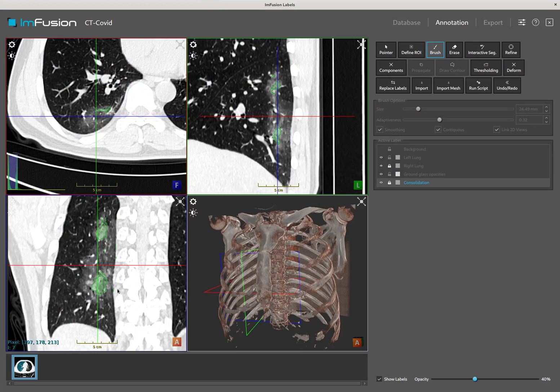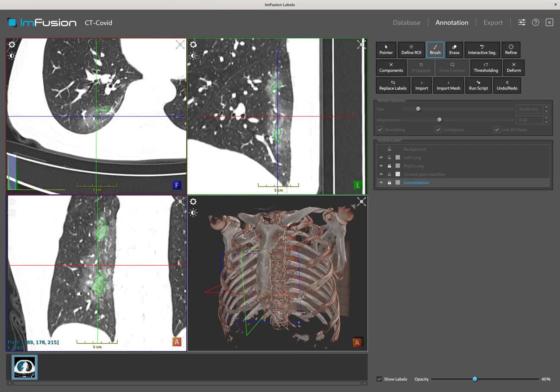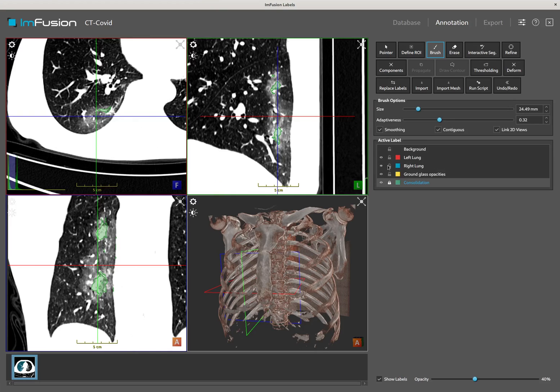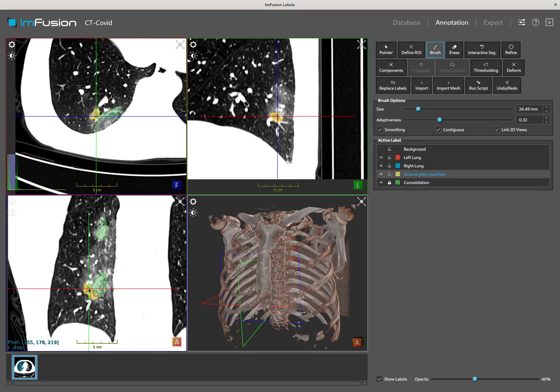I can tweak the windowing to make the ground glass opacity visible, then unlock the healthy lung part and segment them in a similar manner.